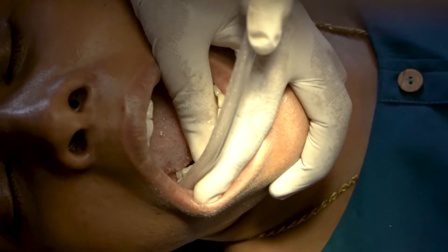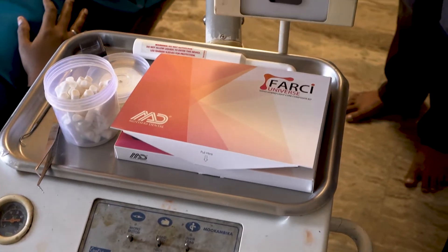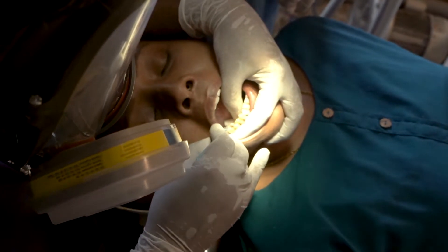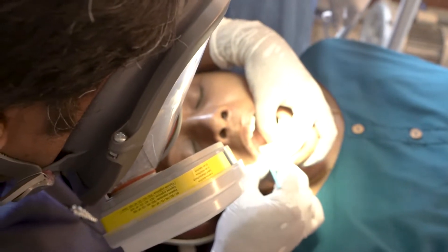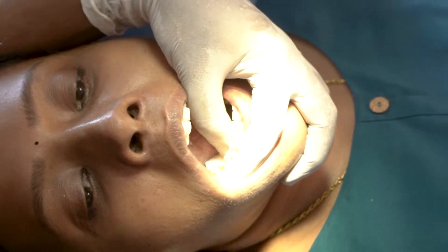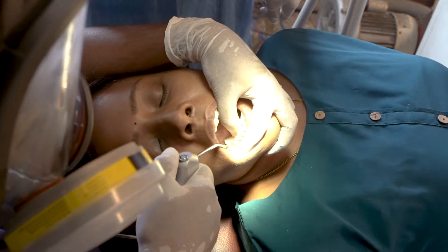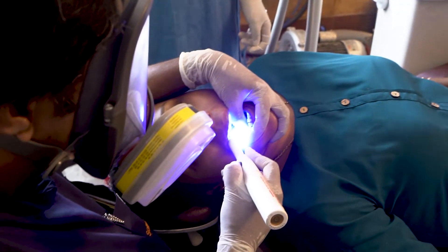The tooth is well isolated. The bonding agent is now being applied — we have the seventh generation bonding agent. The bonding agent is applied on the tooth structure. After leaving for 15 seconds, the tooth is light cured. The tooth is air dried and then light cured again for better bonding.